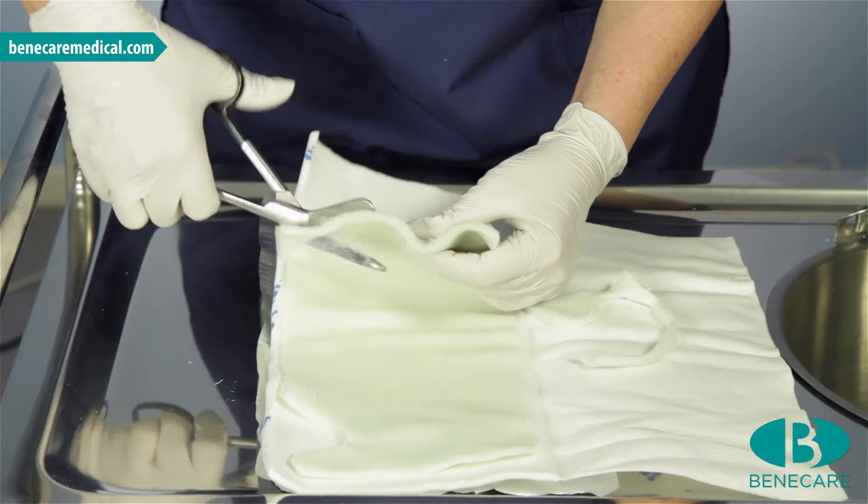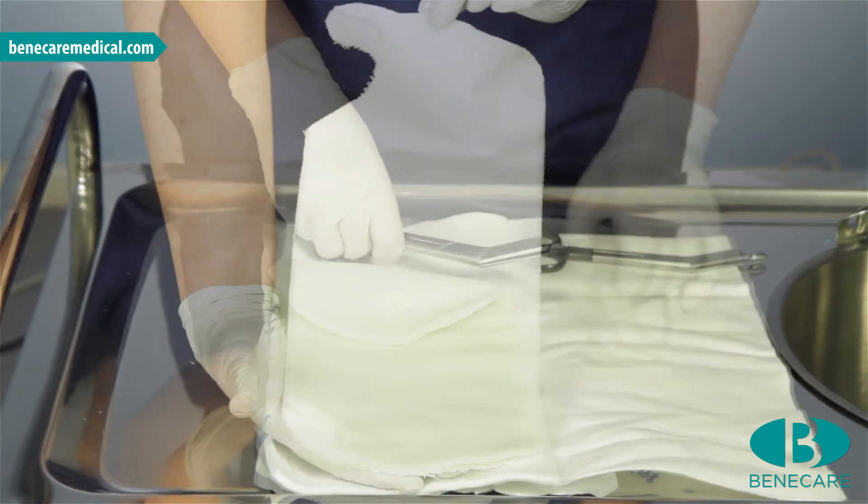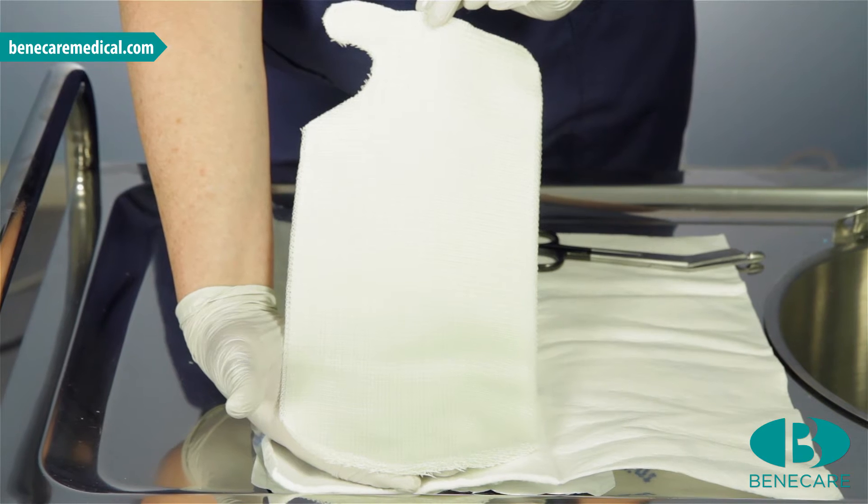Now continue to trim the proximal aspect of the splint by rounding the edges. This is the shape you require. Place the splint back into the padding.